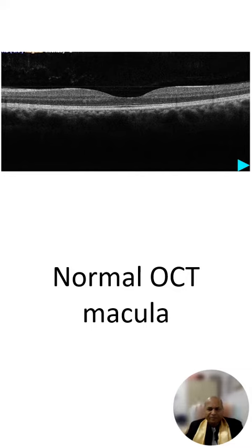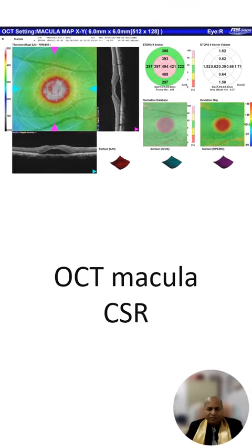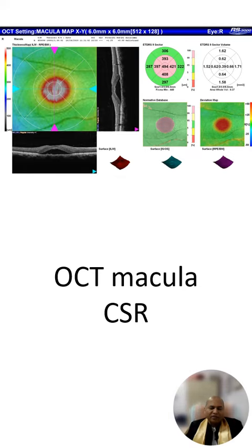This is the OCT of a CSR patient. As we can see, the layers of the retina are separated, and the pseudo color-coded image also shows a thickening between the retinal pigment epithelium and the internal limiting membrane.